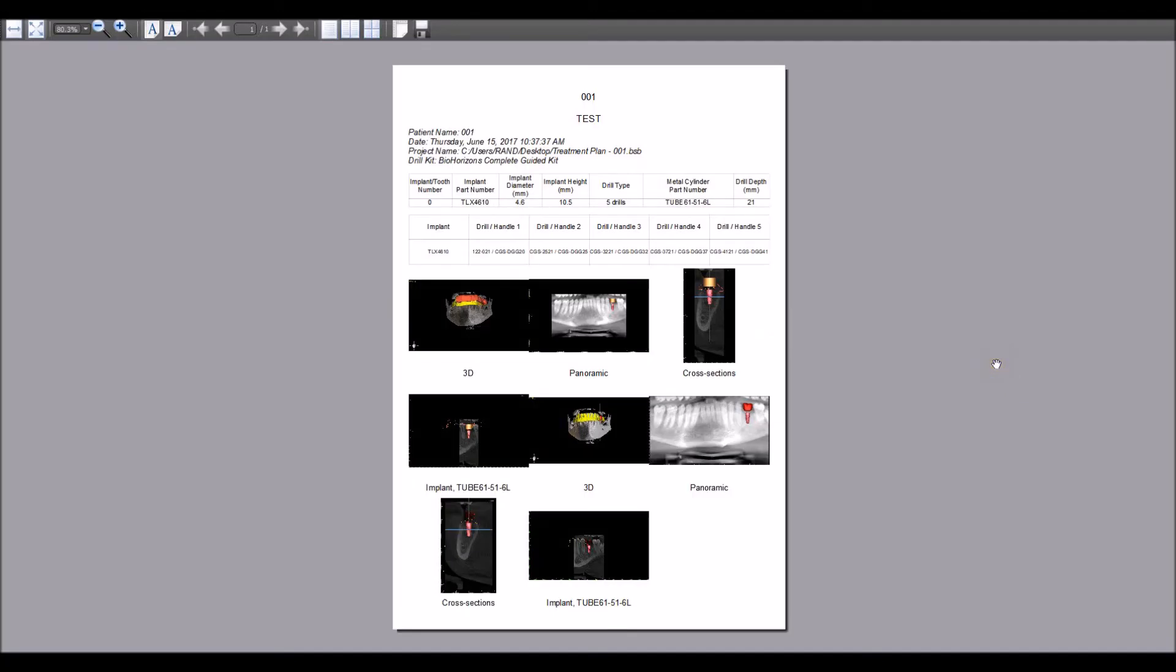As mentioned earlier, the drilling report will show the manufacturer's implant part ID, implant measurements, the metal cylinder sold by BlueSkyBio that will work with the surgical guide, the drill depth, the drill handle sequence, all based on the implant and guided surgical kit that was selected.